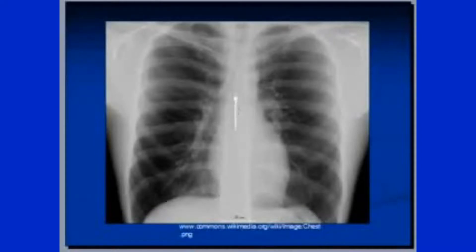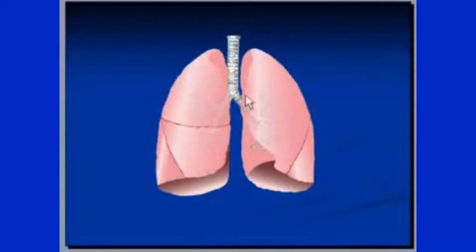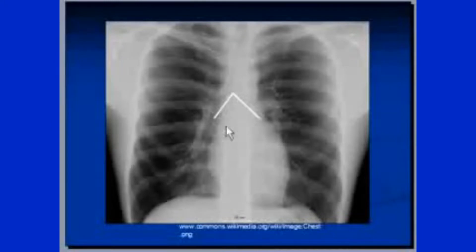This is the carina, where the trachea divides into the right and left main bronchus. The right side is always a bit steeper, which is the reason foreign bodies usually go into the right main bronchus rather than the left. The angle of the carina should normally be less than 90 degrees on an erect view. If it is more than 90 degrees, it means there is a mass or something altering this angle.